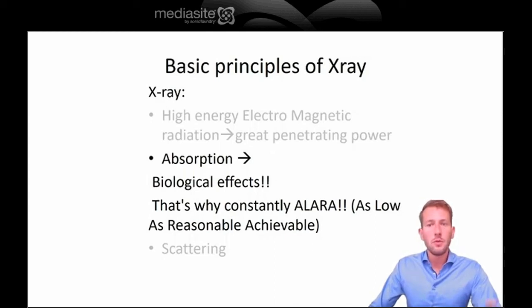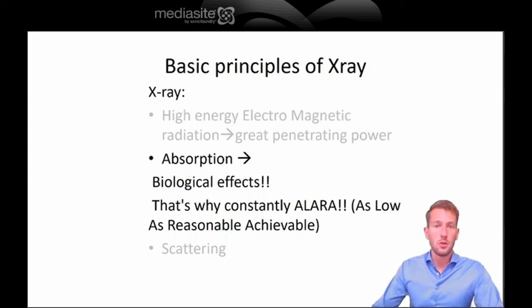Ways how you can account for the ALARA principle in radiology are, for example, assess whether a study which is to be made because a physician asks you to can also be done in different ways. Think about ultrasound or MRI. You can keep the field borders as small as possible, which makes for less radiation, and you can keep the dose as low as possible.